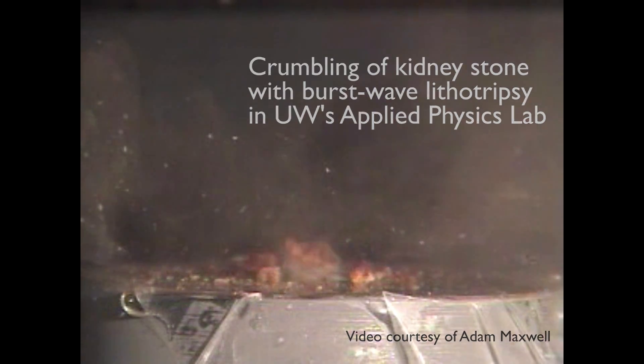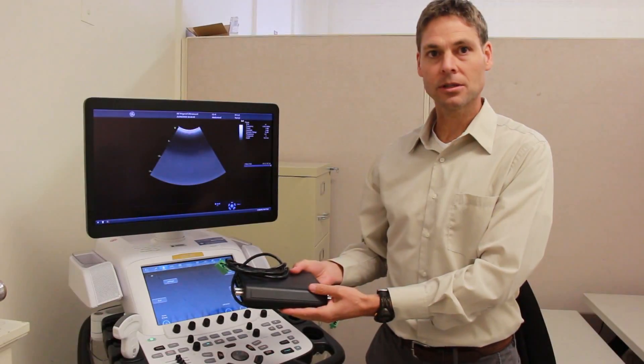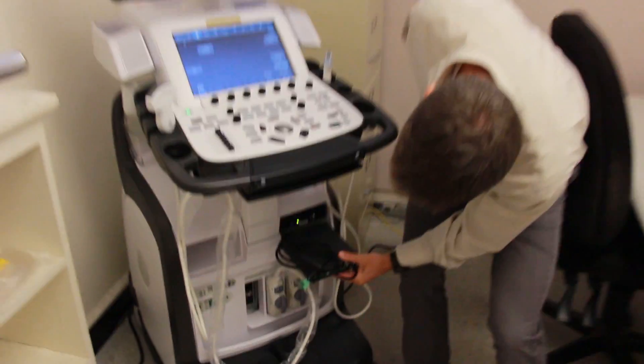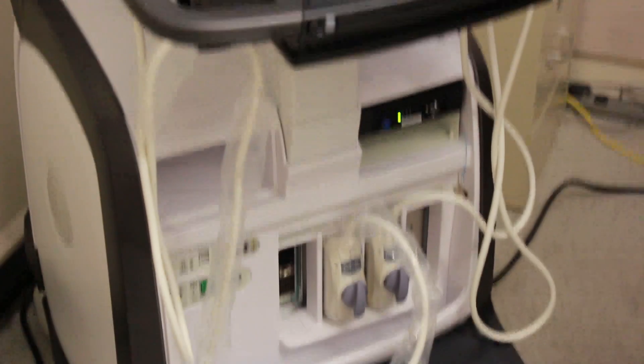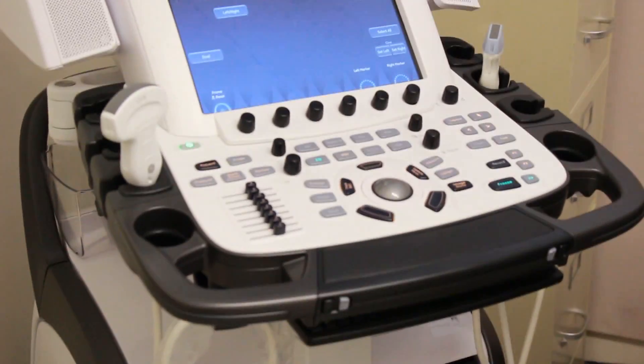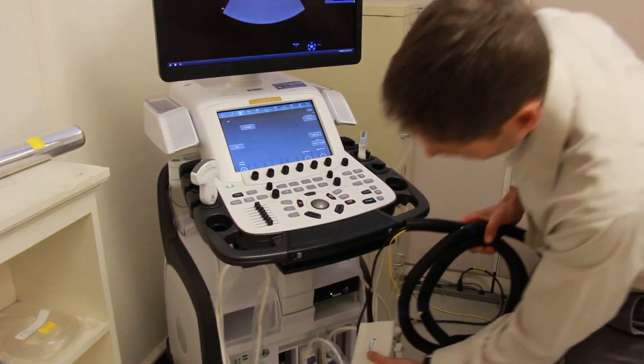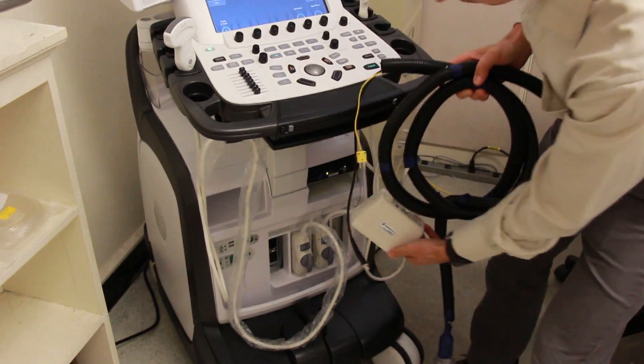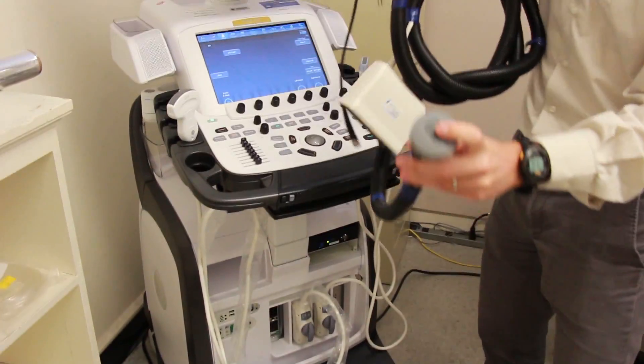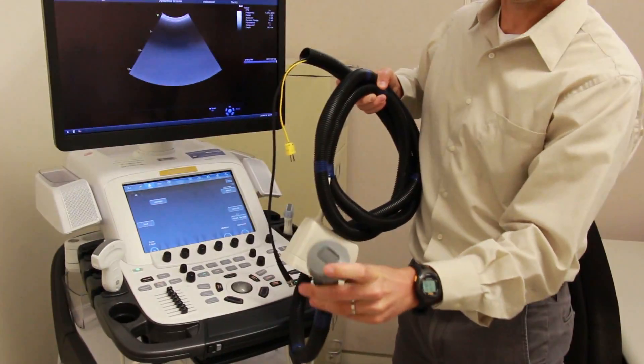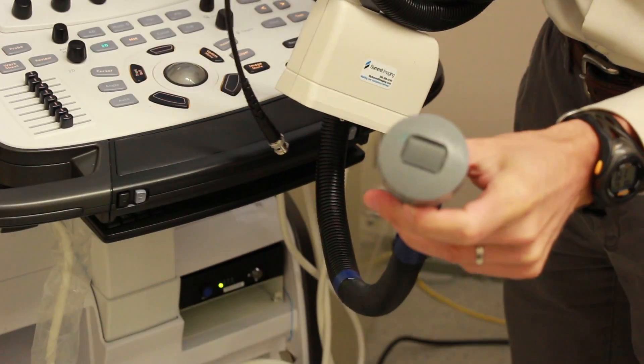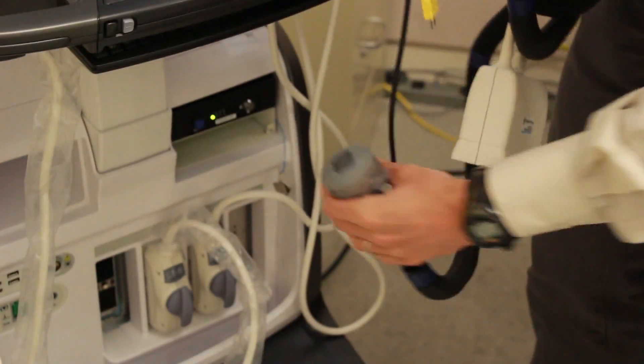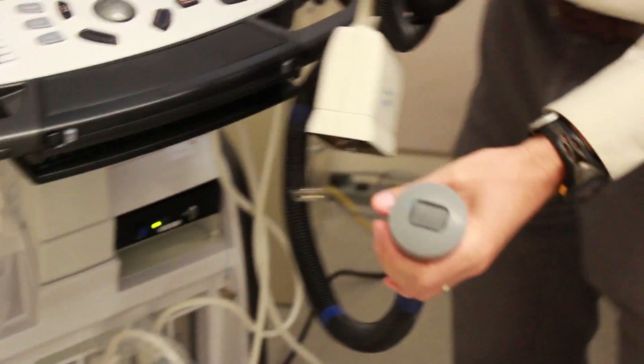We take a small amplifier and power supply this size that will slip into the box right here, and we take a probe that we made. This is the same diagnostic probe, plugs in there, and is in the center of our probe. And then the annulus around it is our therapy probe. The therapy probe is powered by that small power supply that fits in there.